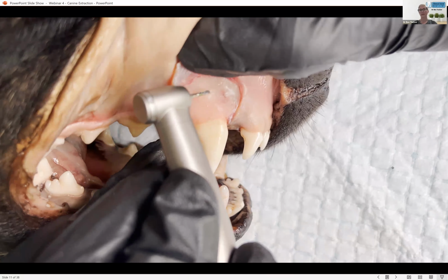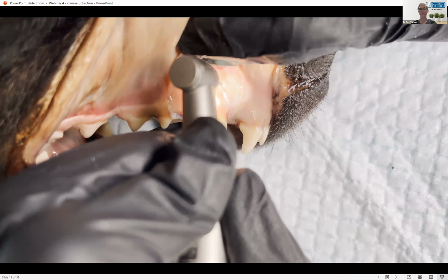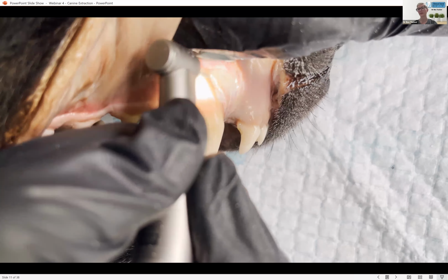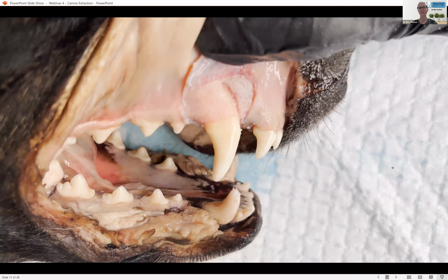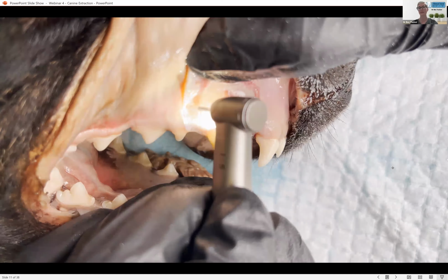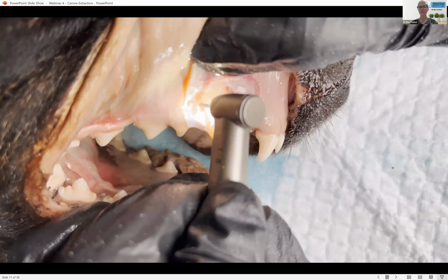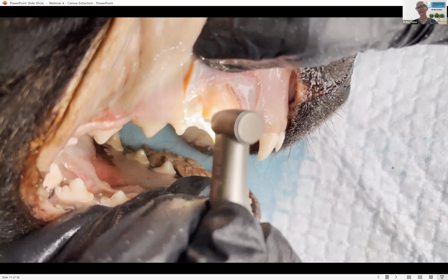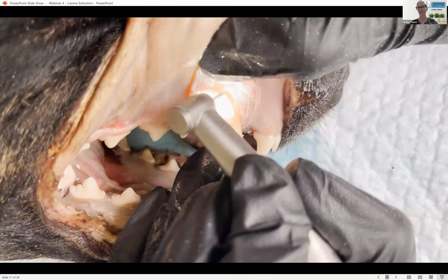Here we go, high-speed burr. The 1558 burr, which you may not have heard of. We love them because they function, in essence, as a round or a taper fissure burr. They actually have a rounded end on them, so you can actually cut with the end. And I really, really like it. So it'll stop us, when we're lazy, from having to swap between a round burr or a straight. If I was using a round burr for this, I'd use a number 4, and I would use that more to remove the buccal bone. To make these deep cuts, I'd probably use a 701L if I was using one of our more standard burrs.